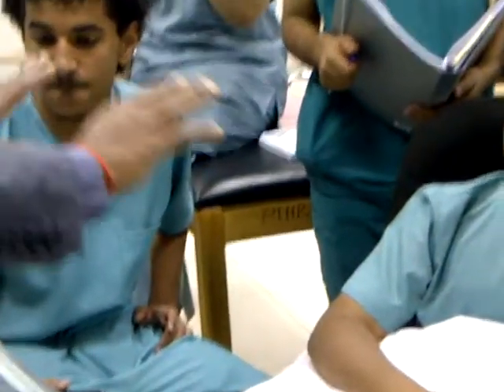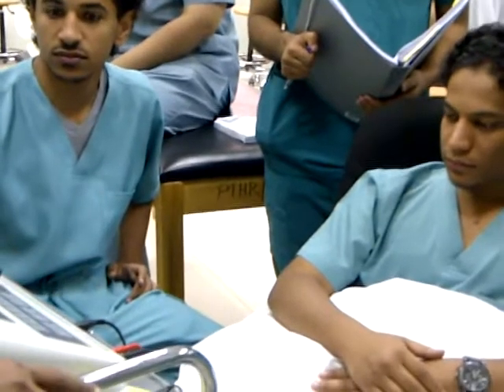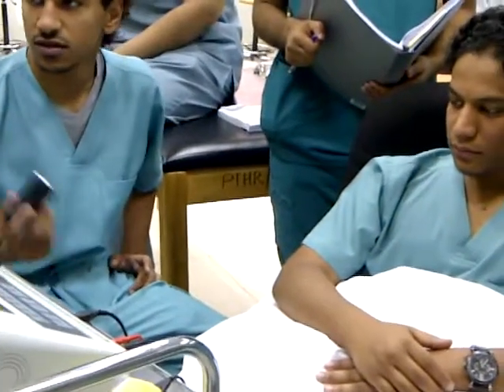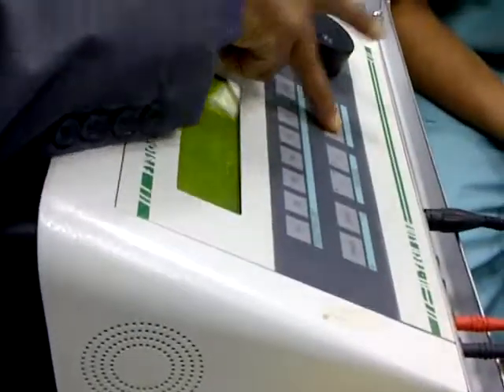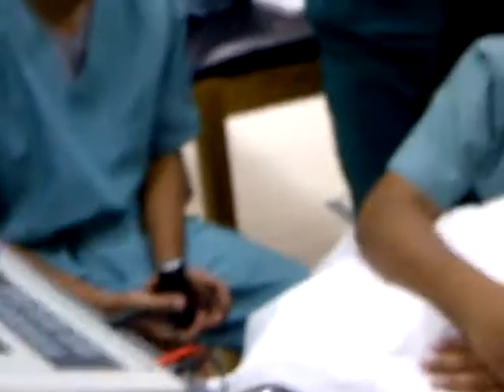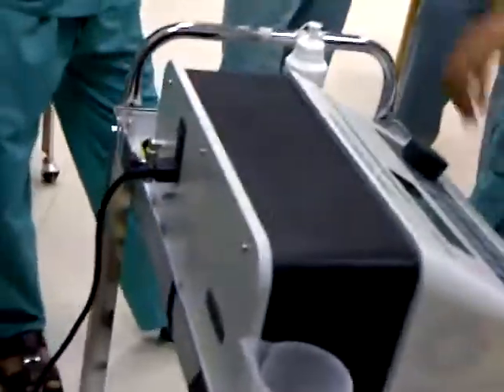Now you have positioned the patient and the therapist is ready. You set the settings now. Suppose he is going to set for acute. I am giving you the condition. Now the patient is acute. Set acute. Switch on the machine from here and do it.